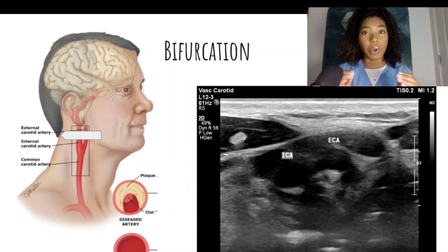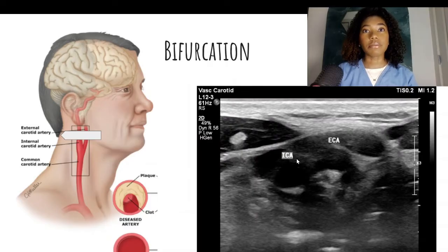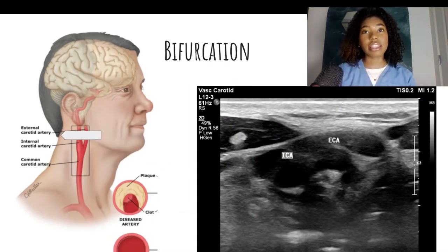There are other ways to tell the difference between the ICA and the ECA when scanning in transverse. The ICA will demonstrate more constant color filling on color Doppler, whereas the ECA will be flashing in color. Lastly, the ICA is often larger in diameter than the ECA.